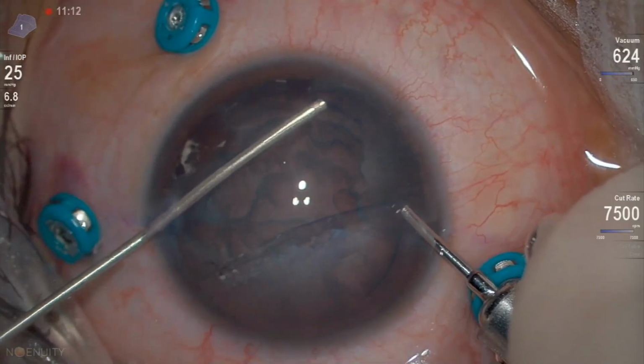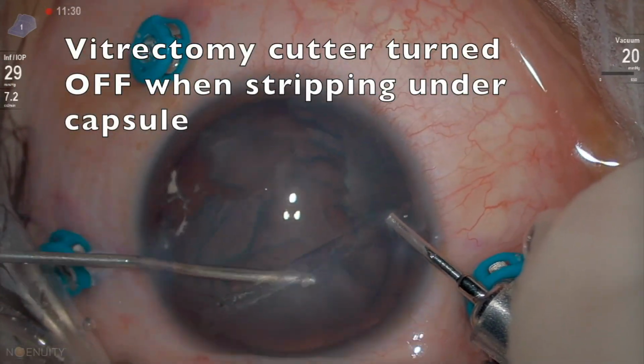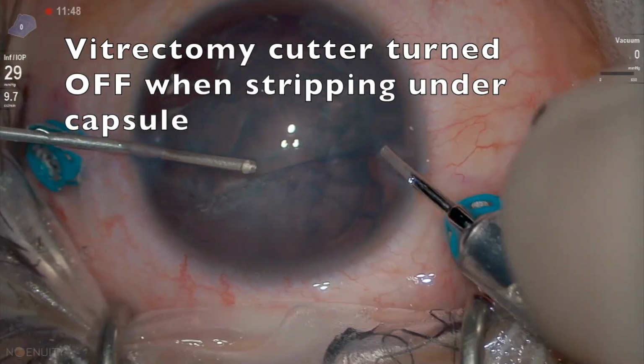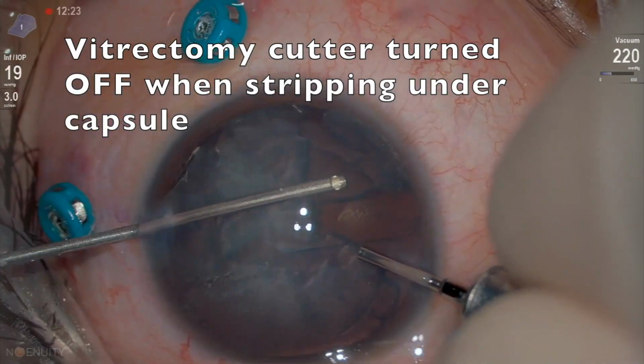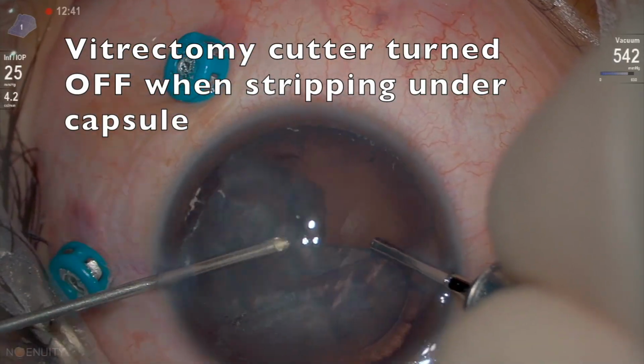With this achieved, now we switch the cutter off and use it to remove the lens material. We're pulling radially, trying to remove the lens matter without damaging the remaining capsule or zonules.